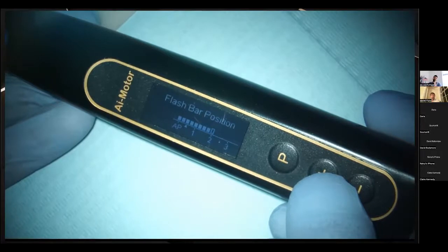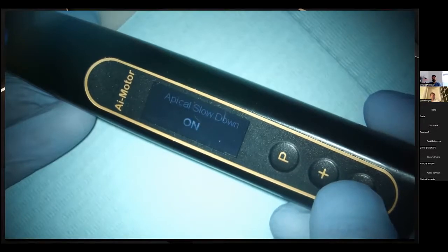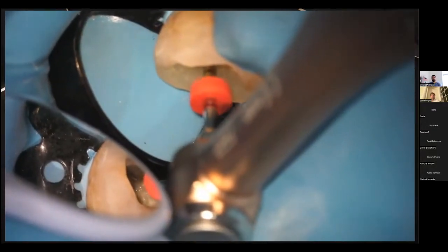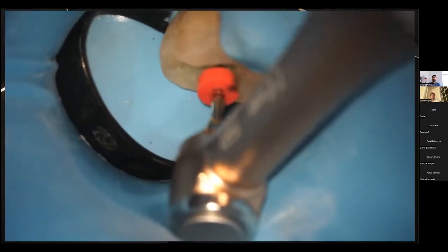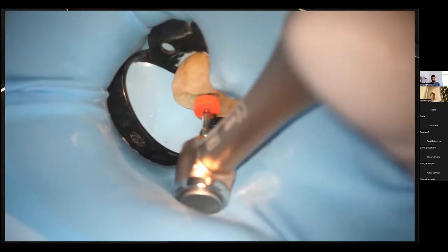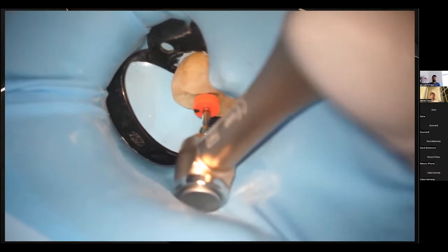So I will also set these motors to have that apical slowdown. What this looks like is I will set it to about 0.5 mils from the 0 reading, in cases like this. Oh, there's no sound. Okay, this doesn't really work without sound, but you'll see that as I'm getting towards the apex, we've got that file slowing down. So with that inbuilt apex locator, it's much more difficult to now just blast past the apex, which I definitely have done on many occasions.